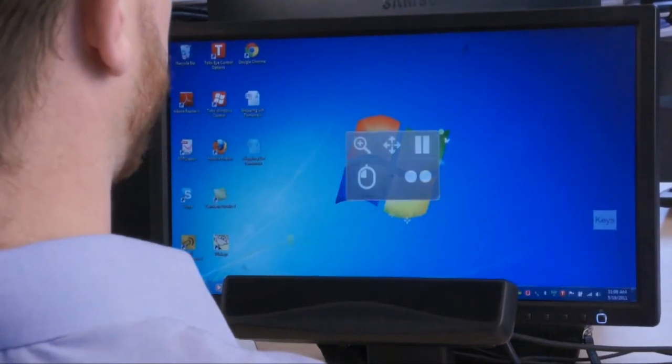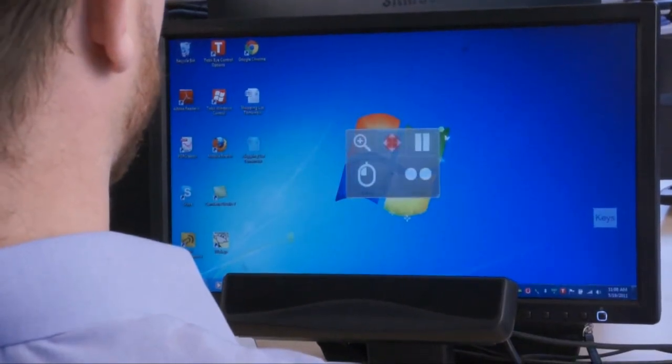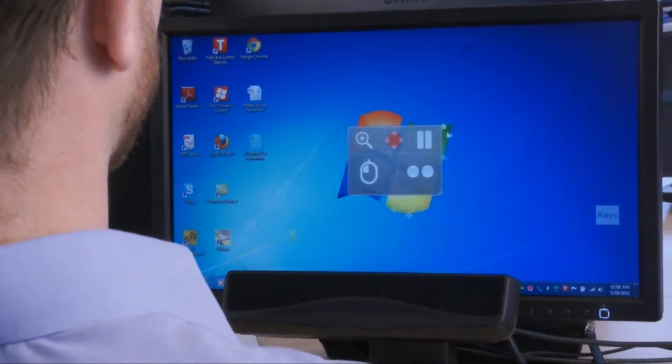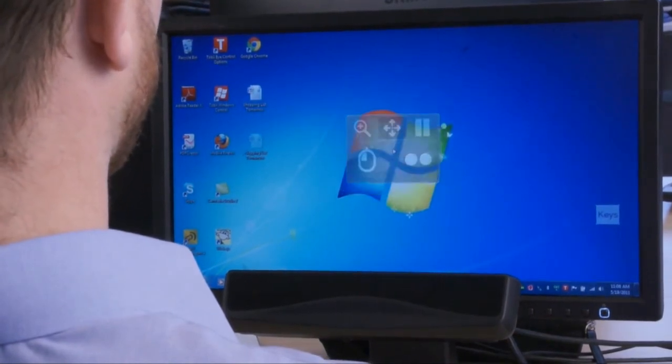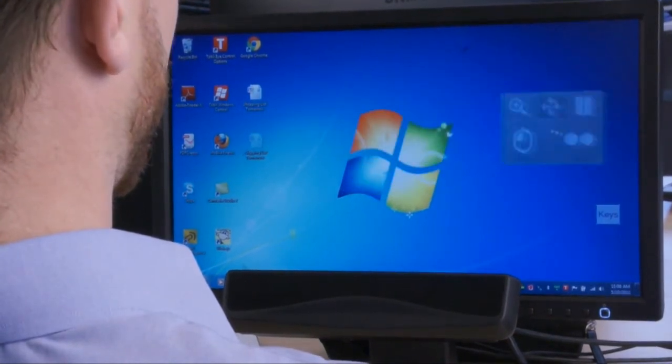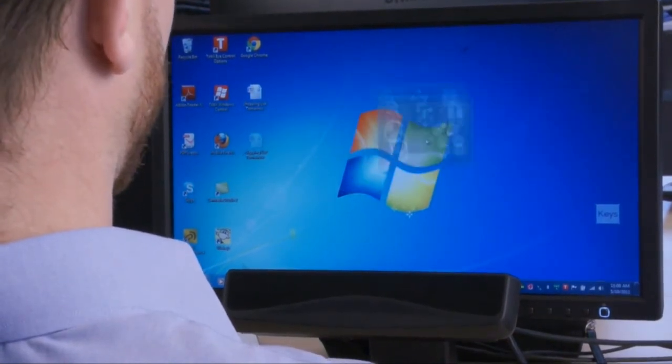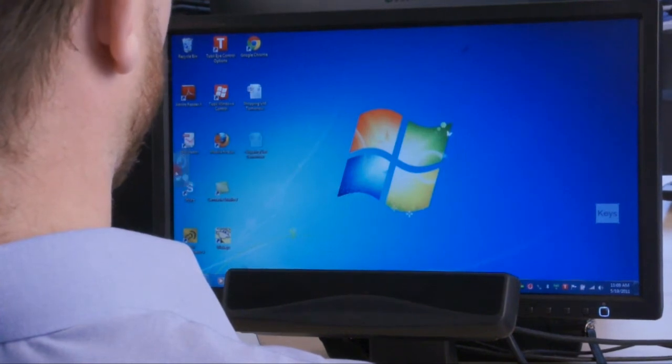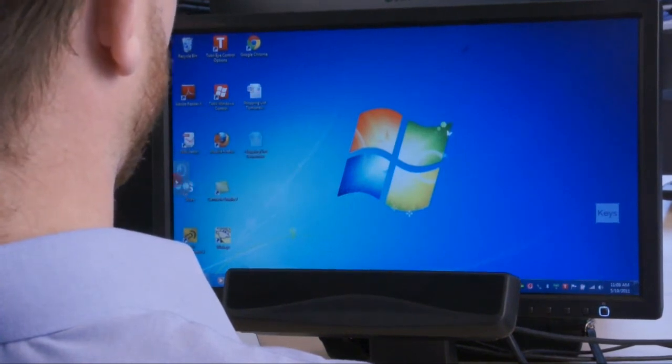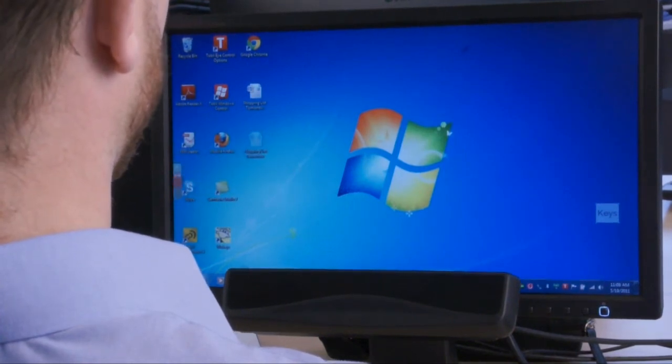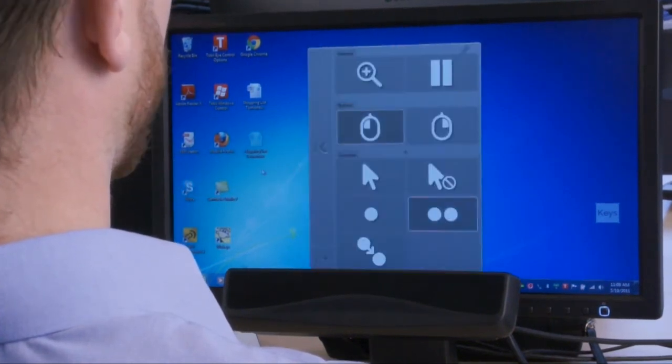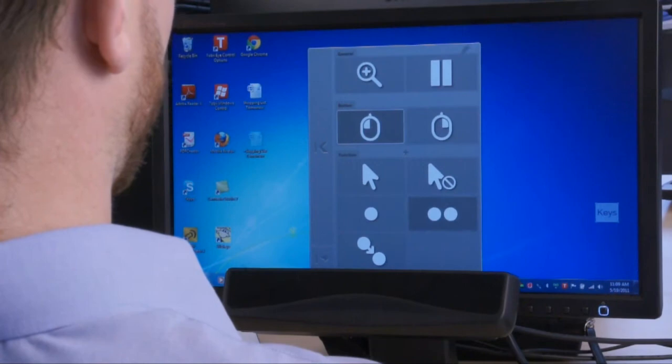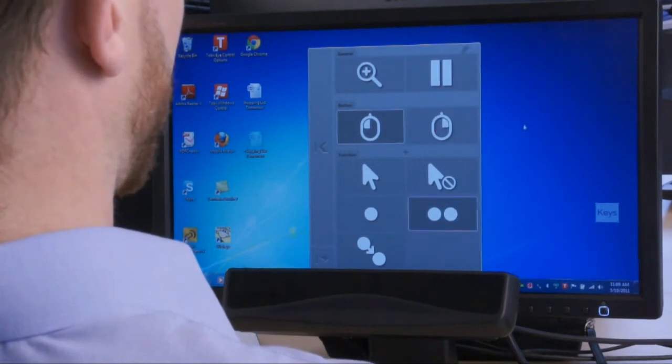What we call Windows Control is eye control in the Windows environment. Make use of a simple Windows Control menu that allows you to choose things like your selection method, allowing you to change between a right and left click, for example. Pin it to the edge of your screen for unintrusive quick access whenever you need it.